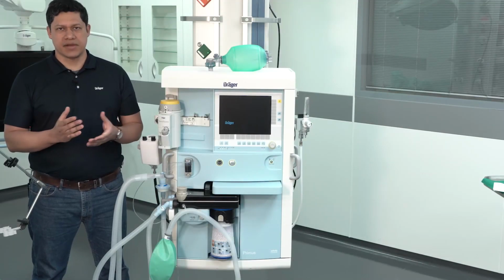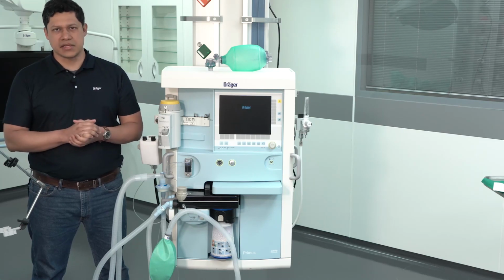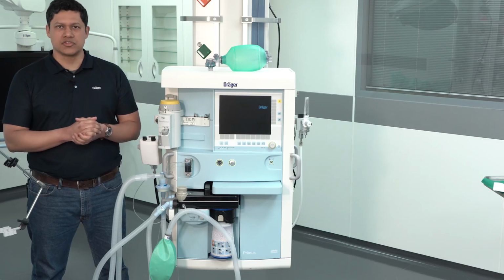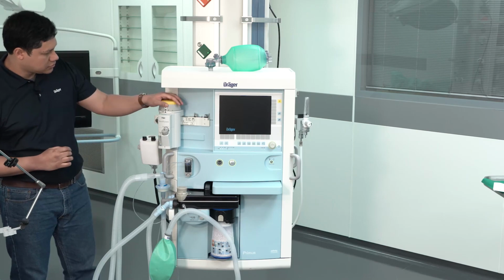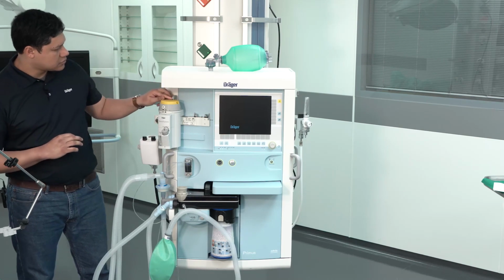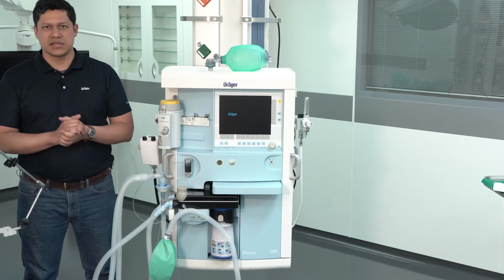Remove all the vaporizers from the anesthesia device. The minimum quantity of anesthetic agent might trigger malignant hyperthermia in the patient or in the medical staff. To do so, press the button and turn the dial to the T position for transport. Then turn the lever. Be aware that the vaporizer is heavy.